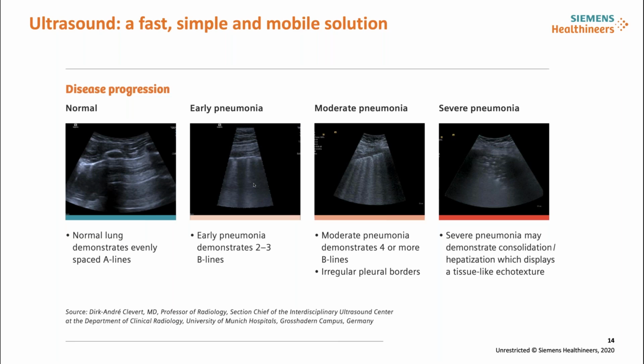It's funny, because when you talk about ultrasound in the lungs, technically you cannot see the lungs because it's air. And with ultrasound, you cannot see the air, right? You have to put, for example, the gel on the transducer, because you don't want to have any air between the probe and the patient's skin. You want to avoid any kind of air, because it gives you artifacts and bad images. And here, the funny thing is that it's the opposite.